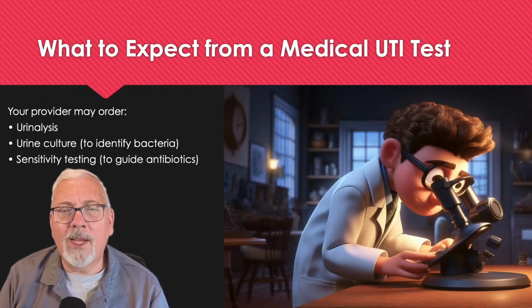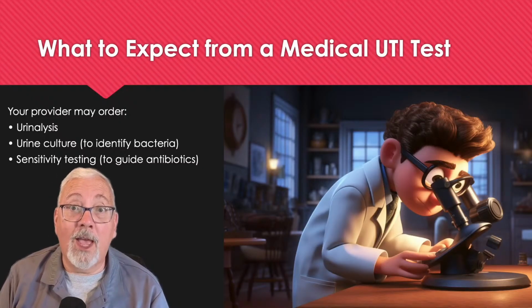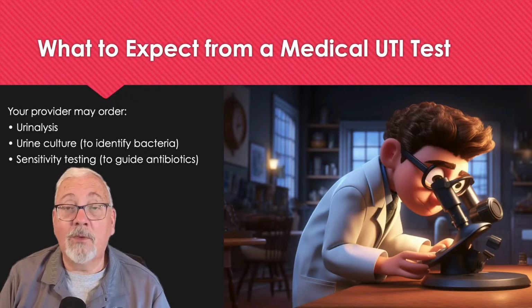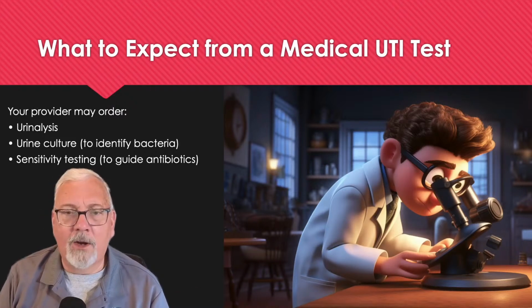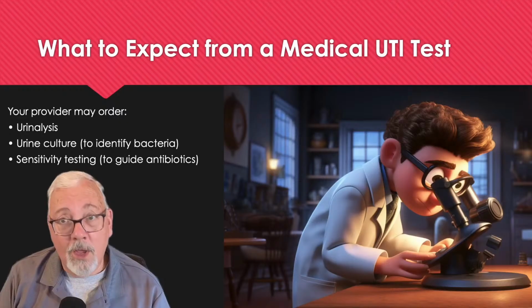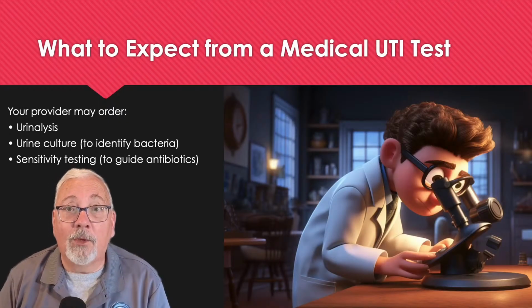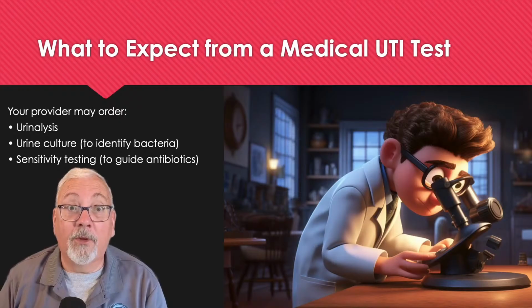So we want to take a look at the urine under the scope, because it'll give you an idea better than just the test strip, or it might tell you whether the test strip was accurate or not. Now, maybe somebody's test strip is negative and they still have a lot of symptoms. Same thing, under the scope. That's the best way. Get a microscopic urinalysis on top of the test. But again, that involves an office visit or sending it off to a laboratory. And if it's positive, they usually follow up with that urine culture where we really grow things out.